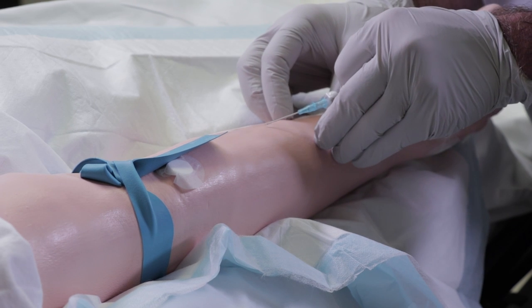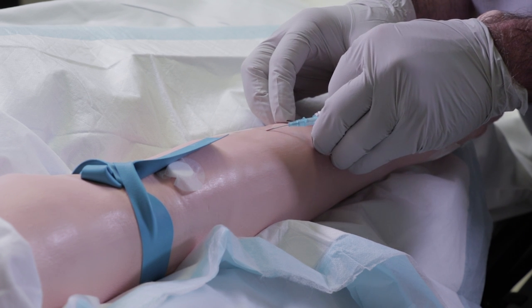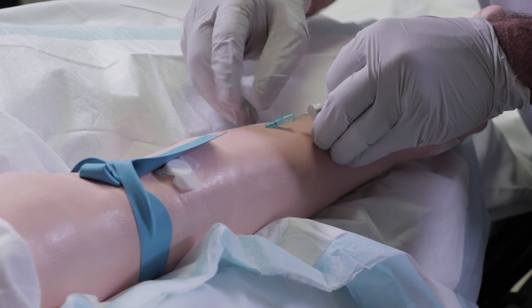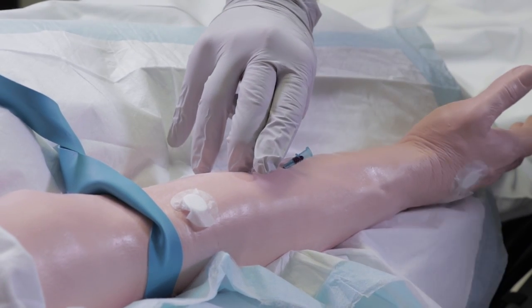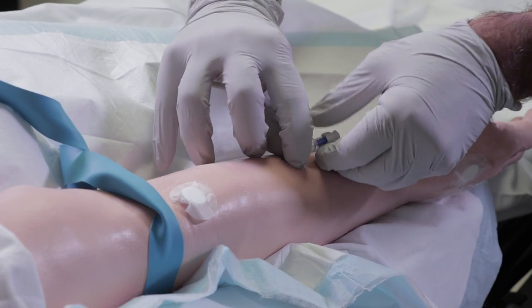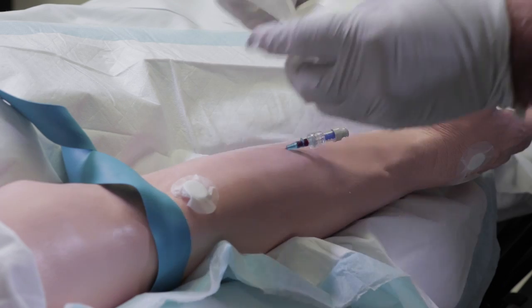Okey dokes now. Unfortunately, this is going to hurt a little bit, okay? Nice and still for me. There we go. That's it. All done. Okay, that's awesome. Oh good. That's good. And dressing on.